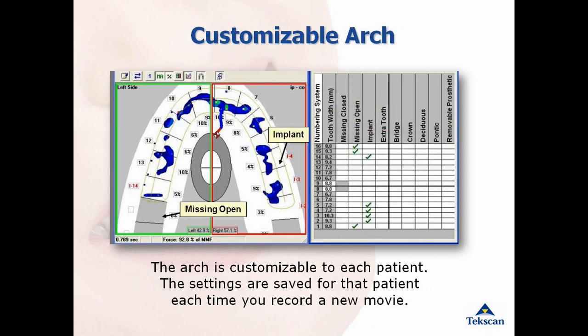The T-Scan gives you the ability to customize the dental arch in the software before each individual patient. You can indicate missing open, missing closed, crowns, implants, and more. This can be done either before or after taking a recording of your patient's bite.